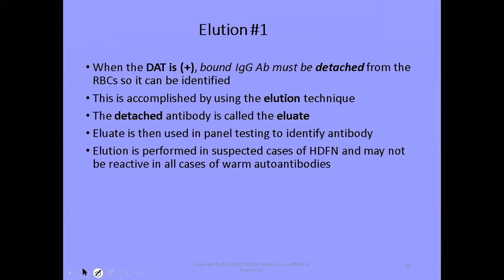Okay, so a couple of other techniques we need to discuss include elution. Elution is sort of the opposite of adsorption. So adsorption basically removes an antibody from a patient's serum or plasma. Elution is the opposite, okay?